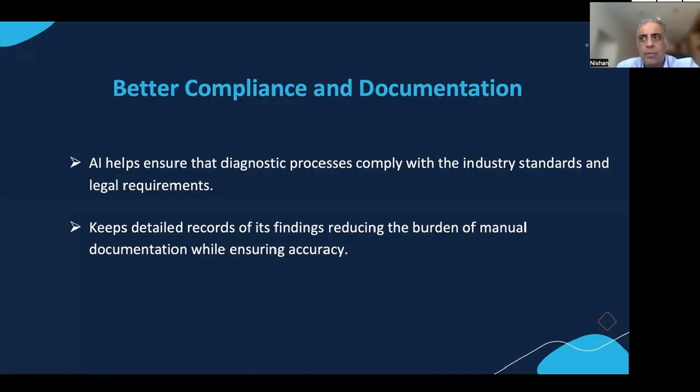You can compare the records over a period of time, like X-rays. If you've got small lesions, a year later or 18 months later, when you take the next set of X-rays, those measurements can be compared, and you can see if there's a deterioration, and whether it needs intervention or not.